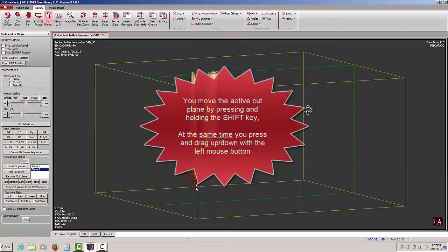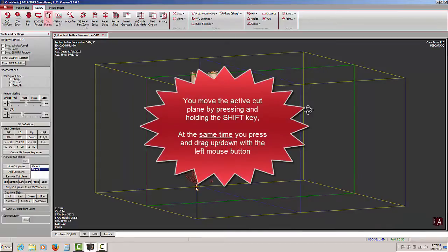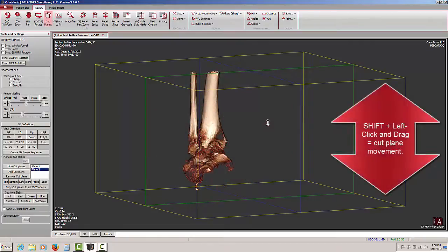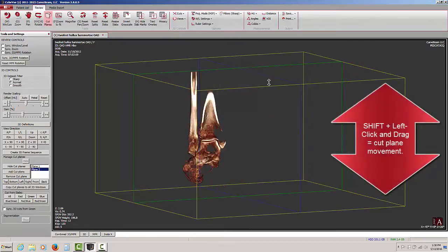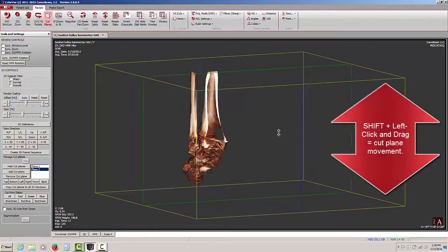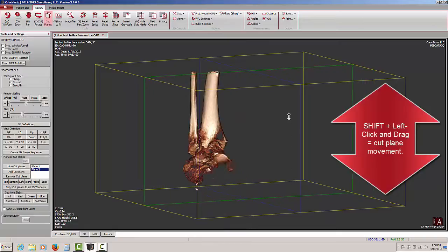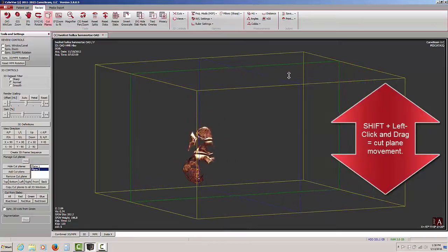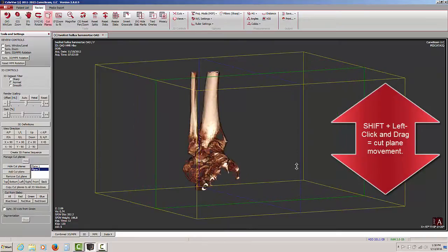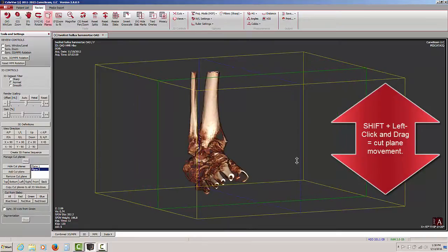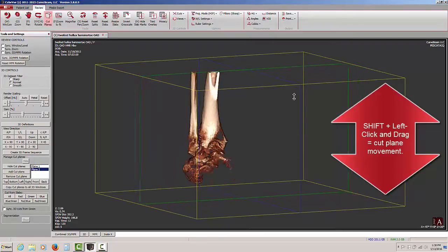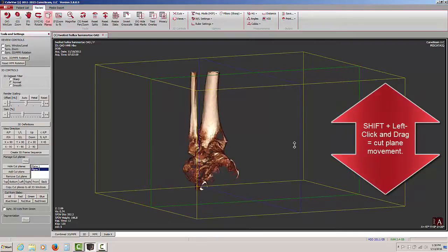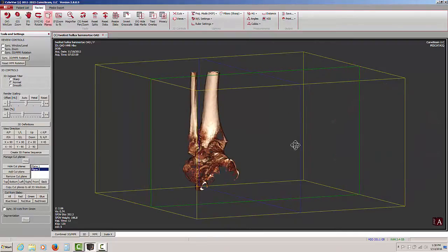I can move the cut planes by pressing and holding down the shift key on my keyboard, and also pressing and holding down my left mouse button, and then dragging my mouse up and down. So the combination of shift key on the keyboard and left mouse button up and down is what will move the cut planes.